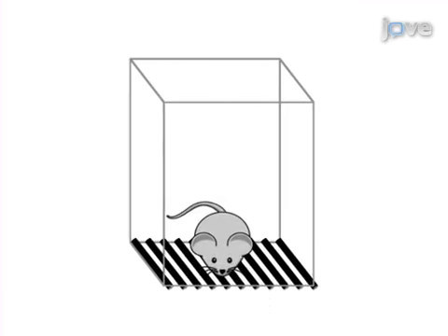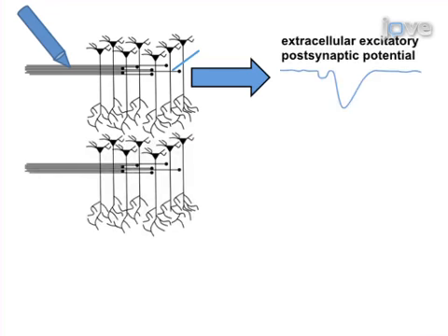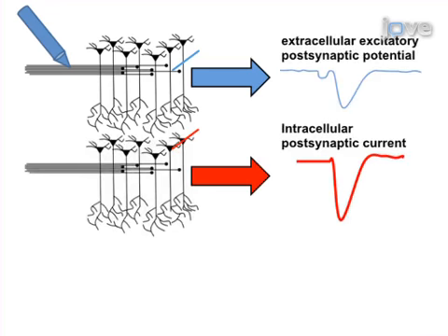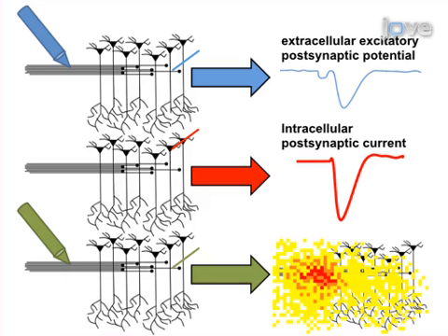As a second step, a hippocampal-dependent behavior, contextual conditioned fear response, is used to assess brain injury-induced cognitive impairment. Next, extracellular and intracellular recordings, along with voltage-sensitive dyes, are used to determine the regionally specific changes in synaptic balance between excitatory and inhibitory synaptic transmission in the region of interest, the hippocampus.